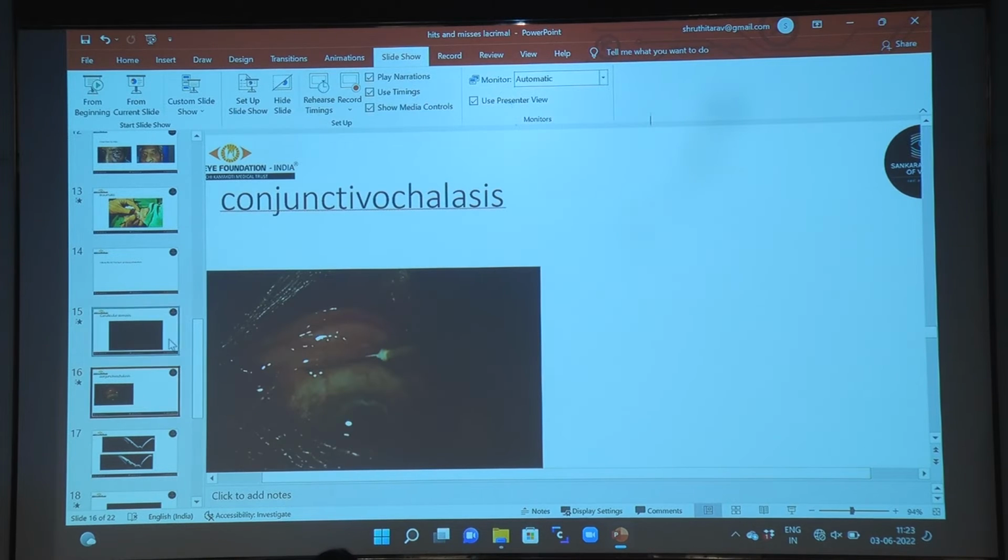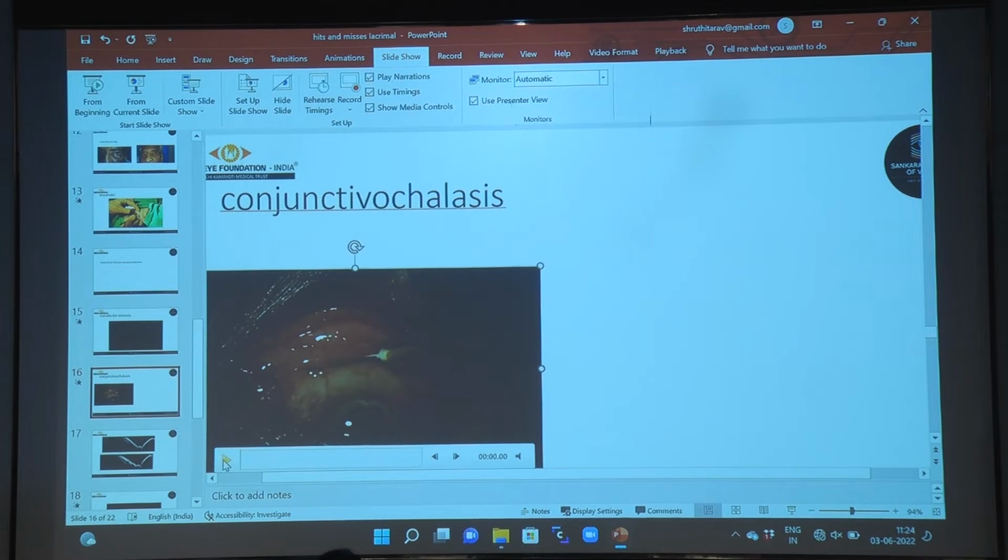Go ahead. This is a conjunctivochalasis patient. Now, what I was doing in the earlier stage, they usually come with surface irregularities and tearing sometimes. So this was in my earlier stage, wherein I would give a subconjunctival block, and then what happens is that the chalasis is completely lost. You don't know where it is. And you can see that I'm lifting up the conjunctiva and then cauterizing. I'm using fulguration here.